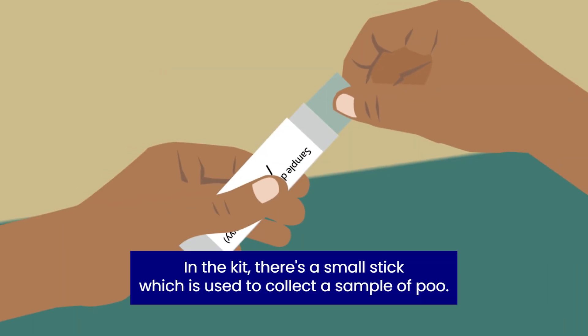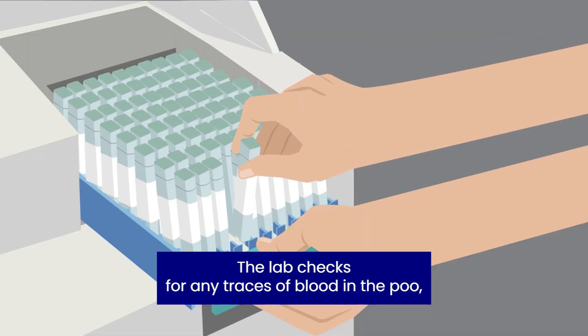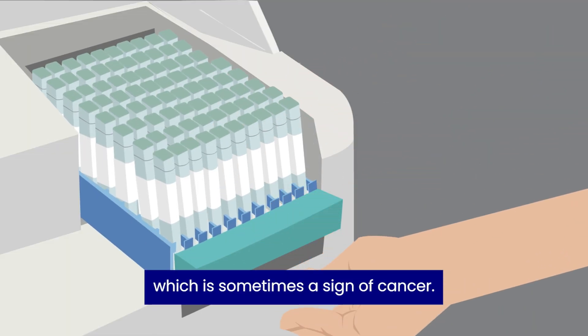In the kit, there's a small stick which is used to collect a sample of poo. The lab checks for any traces of blood in the poo, which is sometimes a sign of cancer.